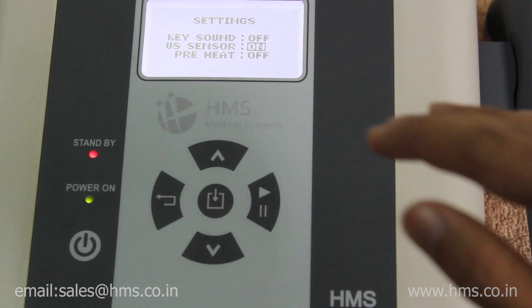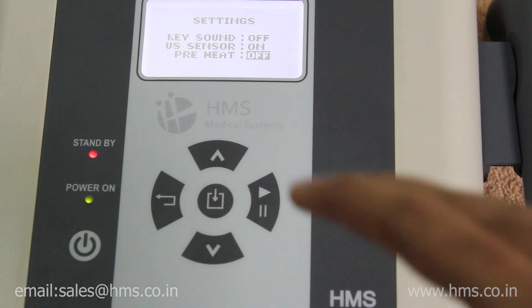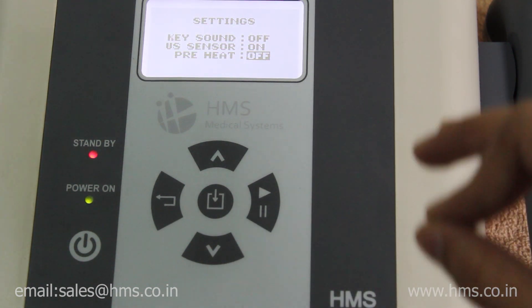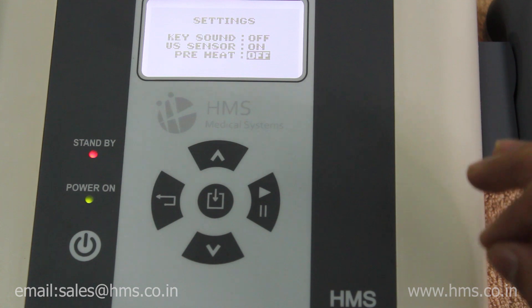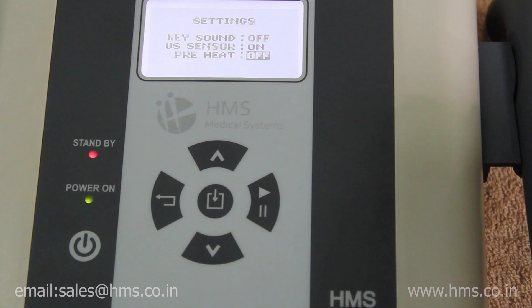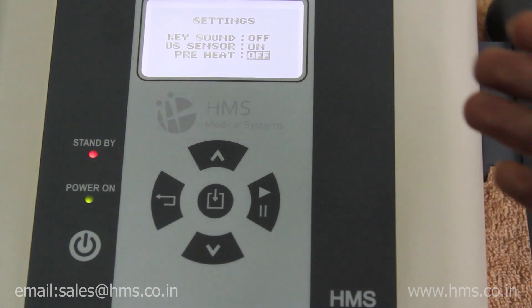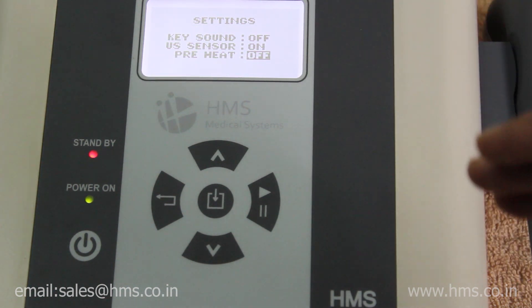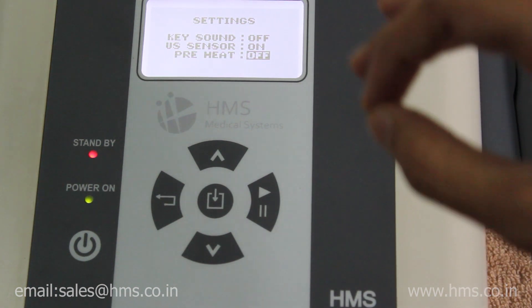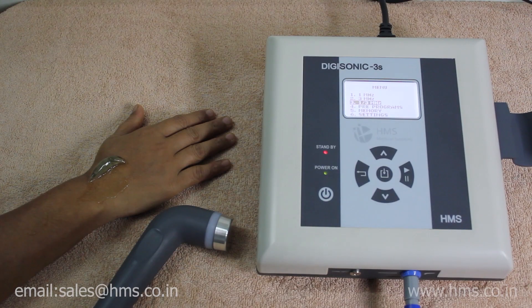Another unique feature exclusive to the Digisonic 3S in India is the preheat feature. During winter seasons, the transducer's metal body may be too cold for treatment. This preheat feature allows you to preheat the transducer before giving any treatment, heating its metal body so treatment can be fast and effective.